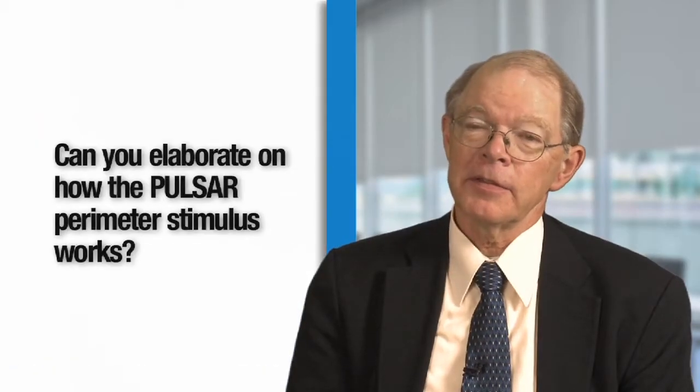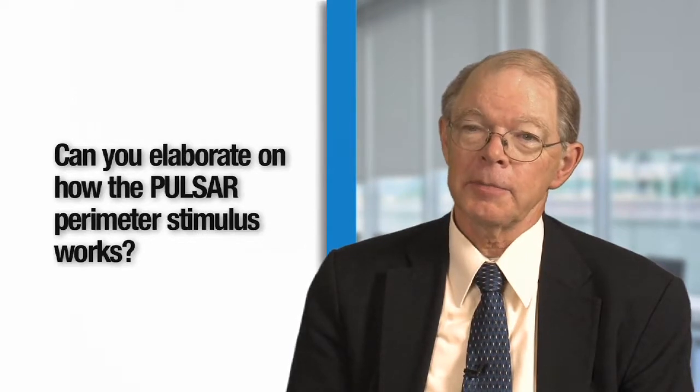Top is tendency-oriented perimetry, and it's a spatial averaging type of procedure. It's one that is bracketing to get to the threshold, so it will present targets that are brighter than can be seen and are dimmer than can be seen, and it then brackets until the person is able to just barely detect the target. It uses neighboring points as well to determine this, and it's a very fast strategy, so it is much more efficient than some of the earlier strategies.